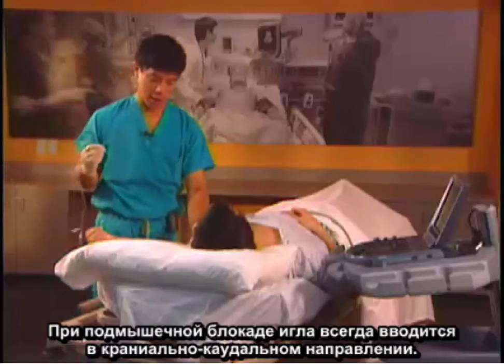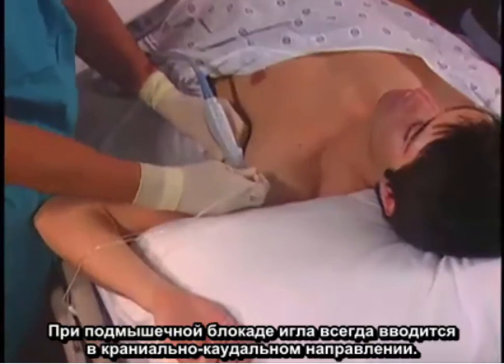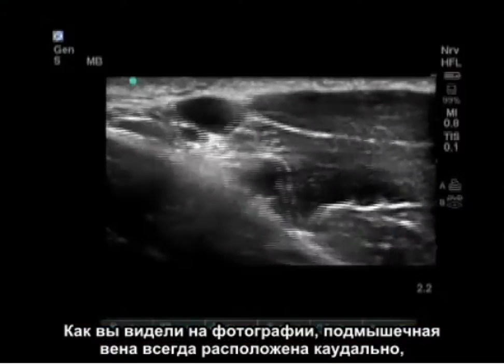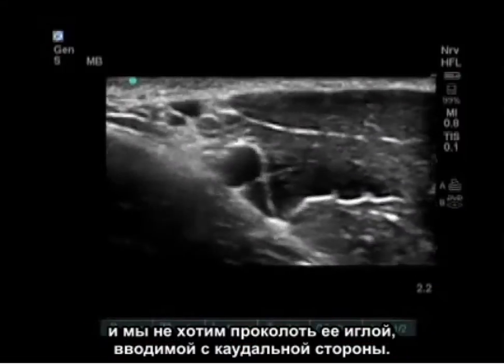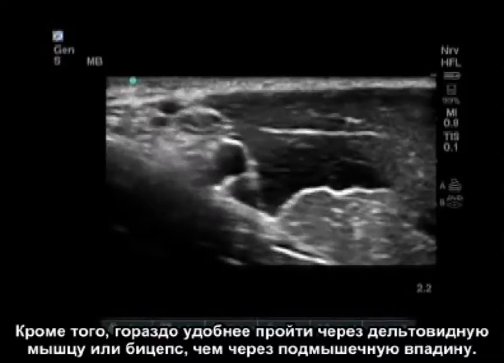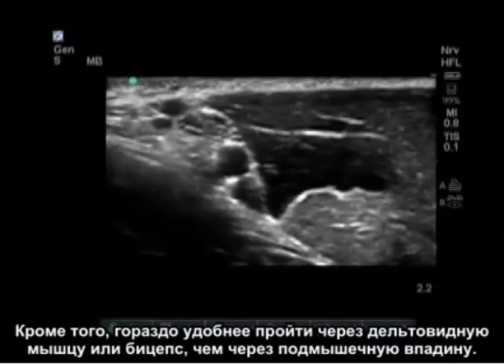Our needle approach to the axillary block is always cranial to caudal. The reason we come cranial to caudal is for two reasons: the axillary vein usually lies caudal and we do not want to puncture it with a needle approach from the caudal side. Also, it is much cleaner to go through the deltoid or the biceps rather than the axilla.